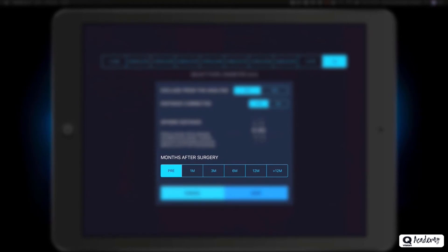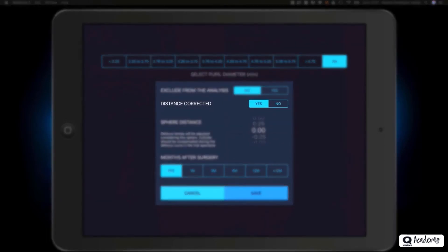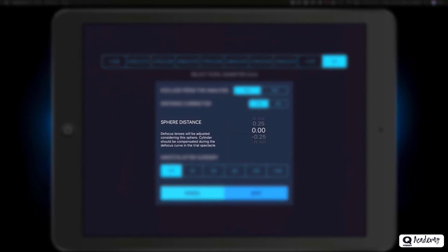We can also select the follow-up period. For example, if the measurement is preoperative, or any of the follow-up months from 1 month to more than 12 months. Finally, very important for the development of the test, we find the option distance corrected, for measurements with the best corrected distance refraction.